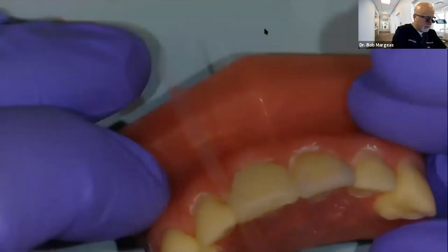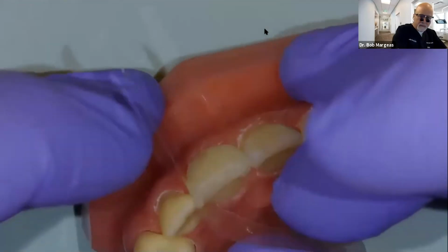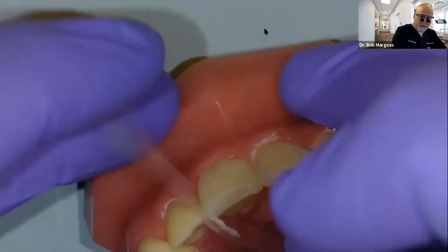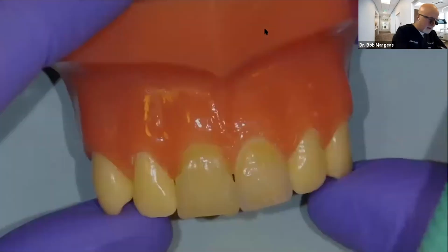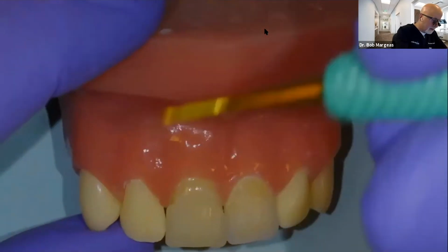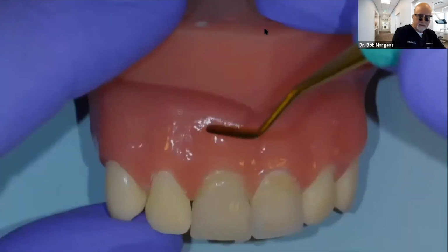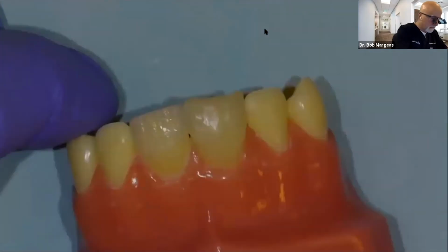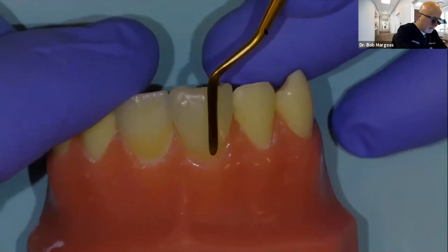And then I'll go to the next side like this. I'll hold my material here against my finger. I'm forming it and then pull it through. And it will go through like that. And then what do I have to do? Got to tuck this in. Got to tuck it in. Blend this up.